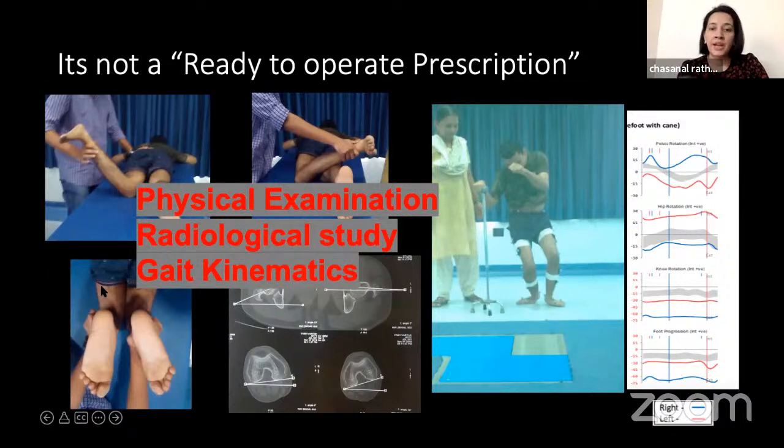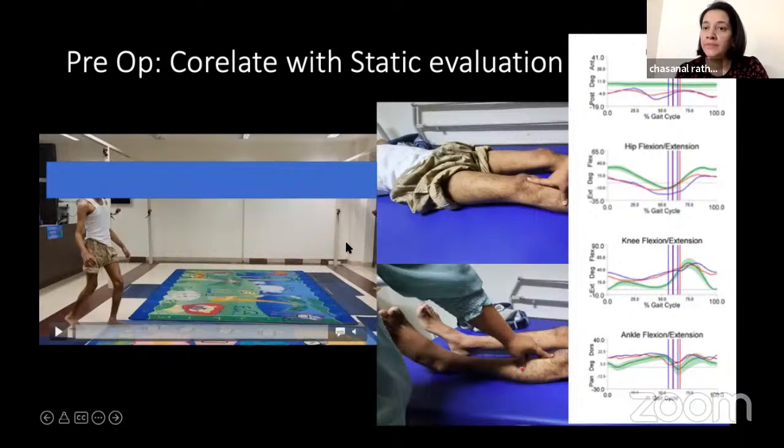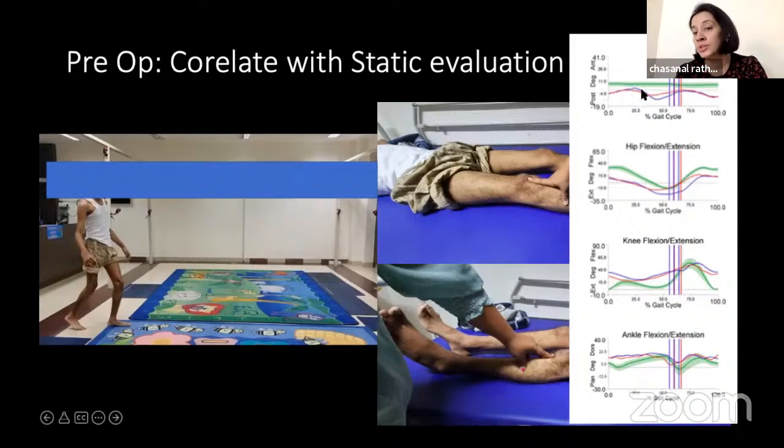But when I checked him in the supine position, there was no knee flexion deformity. So now this is a child where Botox will help. And we know what is happening here. And again, with his aid, we would still think that if a lengthening is to be done or a botulinum toxin injection needs to be done, then based on these two graphs, it will be the decision making between doing a chemodenervation or a muscle or myofascial lengthening in that case.